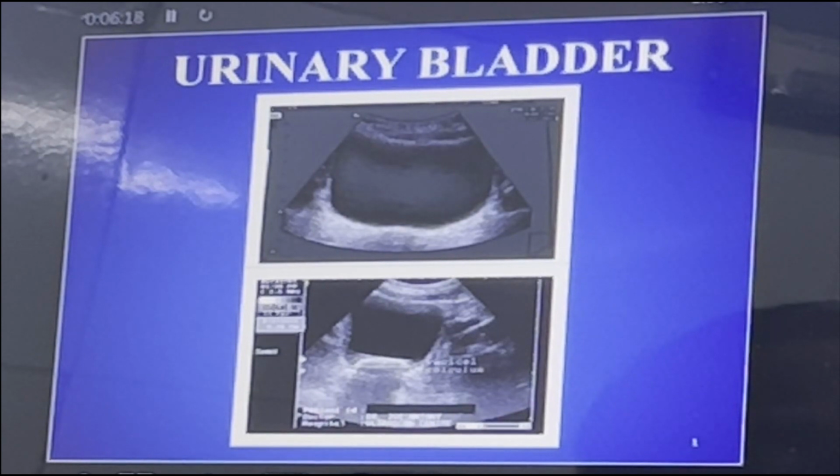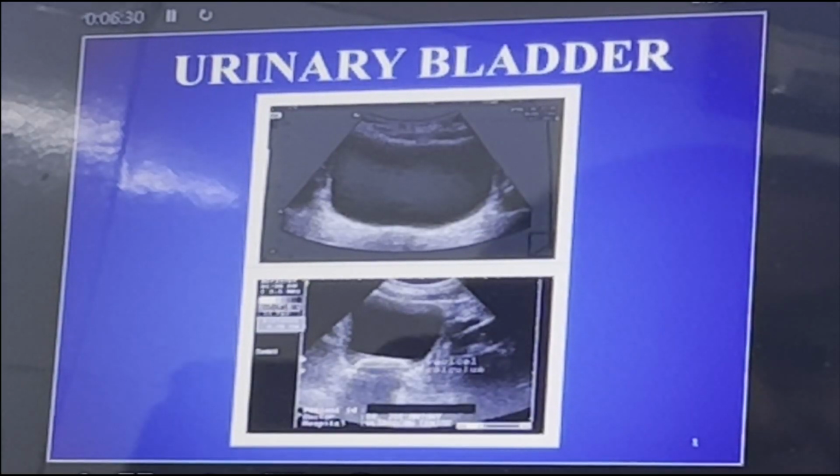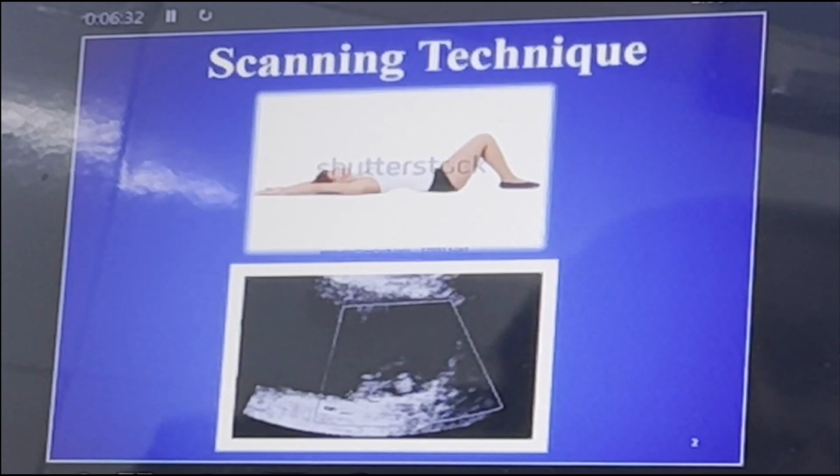Bladder stones are highly echogenic, so you can visualize the stone very nicely, and there should be posterior shadowing of the urinary stone. Now come to the scanning technique.